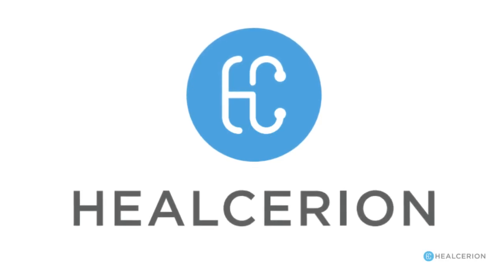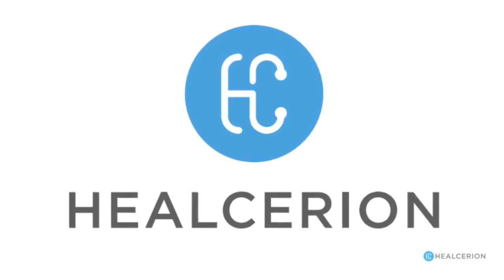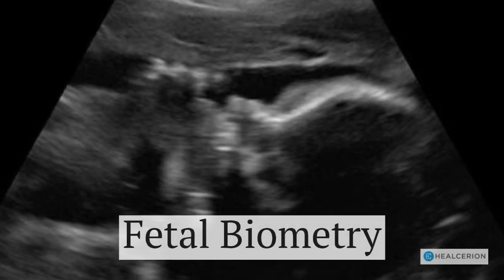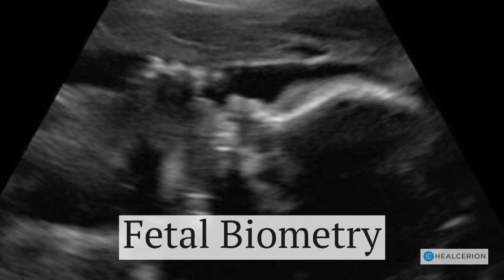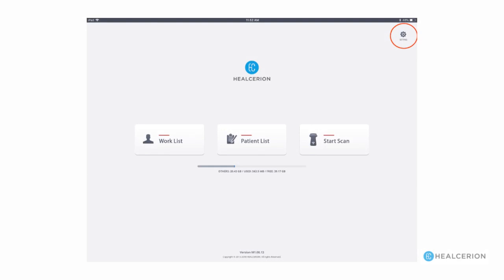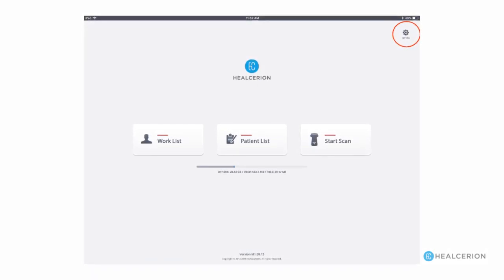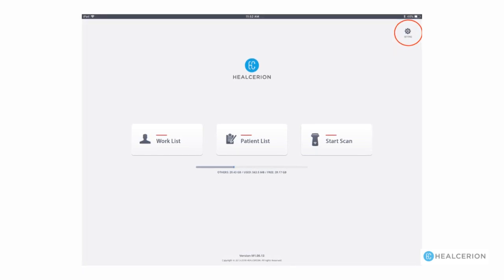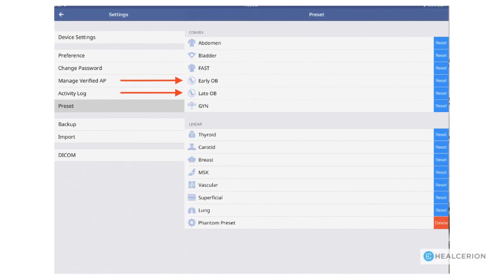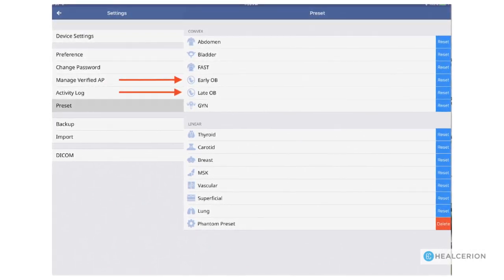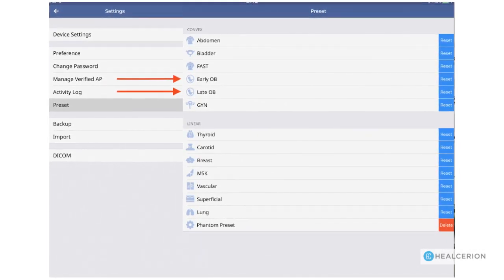Welcome to another Helcerion Sonon series of ultrasound trainings. This video will show you how to find and use the fetal biometry measurements. Each Sonon ultrasound transducer comes factory loaded with its own presets. Choose the settings menu to find them. The 300C convex transducer already has presets for early and late obstetrical studies.